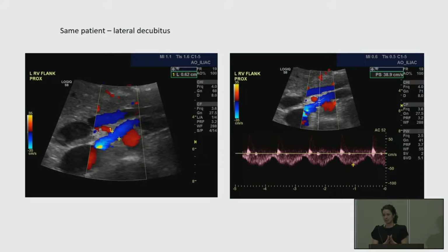It's easy. These patients tend to be very thin because there's not a lot of fat between the vein and the artery that it's getting pushed up against. So when you have them on their back, you have the artery pushing against it along with the gravity causing a stenosis. Turn them on their side, get all of that pressure off of there, and you're going to see a dramatic change in the velocity and then the diameter as well.